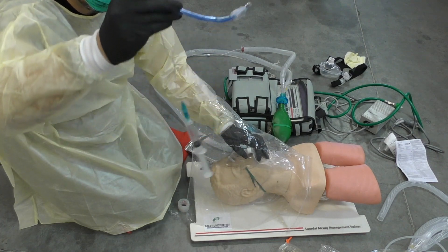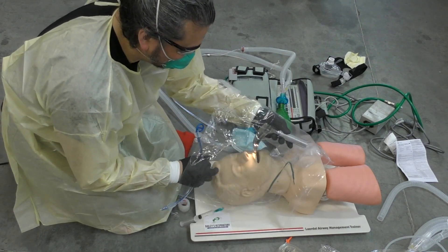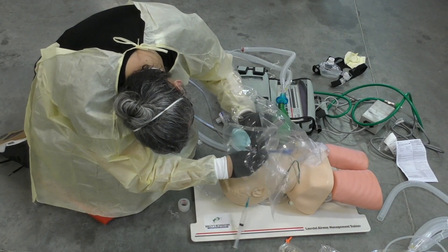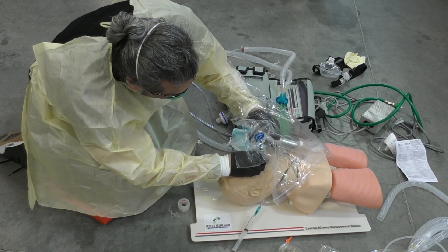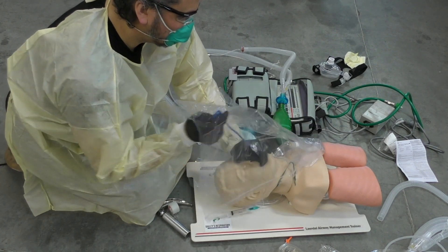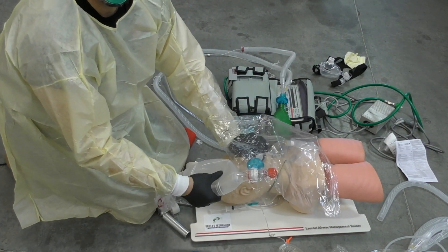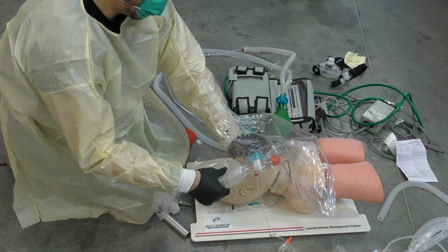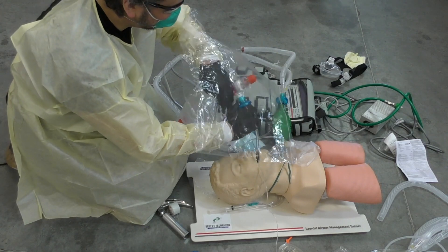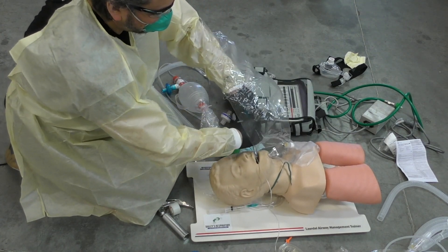I have my ET tube with my 10cc syringe ready to go — let's intubate. I'm doing everything under this barrier. I can see my cords, I'm in. Slowly pick out the blade, stylet comes out — all underneath the barrier. Tube is in, cuff is up. I have bilateral breath sounds and capnography confirmed. I have my vent set up and I'm going to switch everything over, all under the barrier.